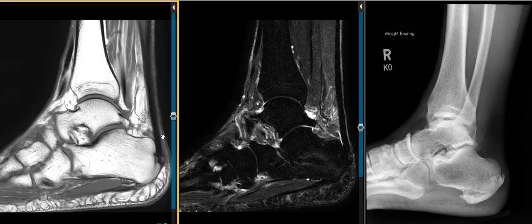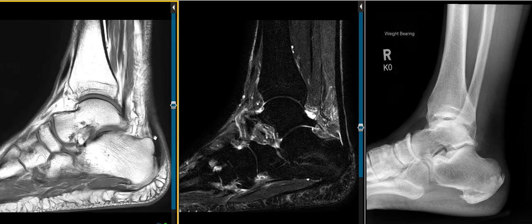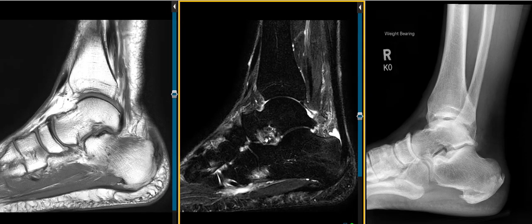This is the back of the calcaneus back here, the posterior calcaneus. This dark band is the Achilles tendon that comes down here. The muscles end, and we have a dark tendon that comes down. It's relatively low in signal, with a little bit of increased signal here along the outer edge. And this is what we call tendinosis. When it's not jet black and it looks more gray like this, we call that tendinosis.